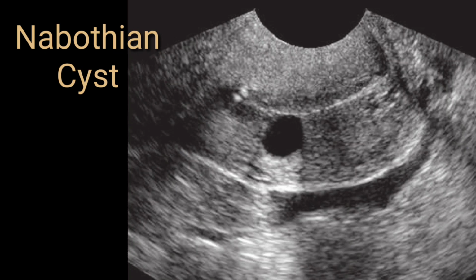Nabothian cyst may be single, may be multiple, depending on its number. So mention that a Nabothian cyst can be seen in the cervical posterior wall, measuring that much, and always mention the internal contents, whether there is any internal content within it or not, any calcification or not, because if it is simple, it will not give you any symptom.